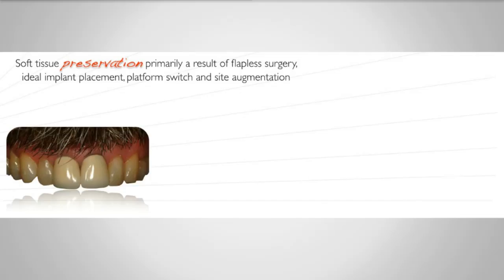It's not just the provisional restoration. Your soft tissue preservation is a result of, first of all, a good site, flapless procedure, flapless surgery, ideal implant placement. In this case, we did a platform switch. I'm not sure that made that much of a difference.